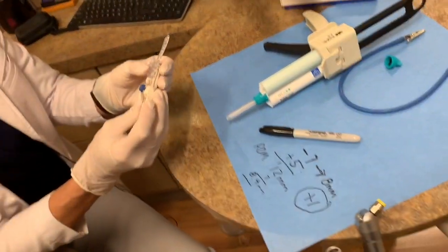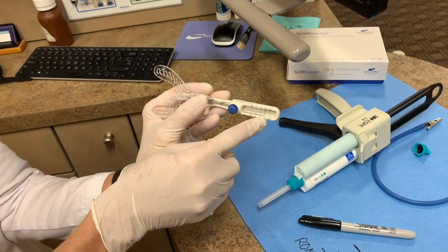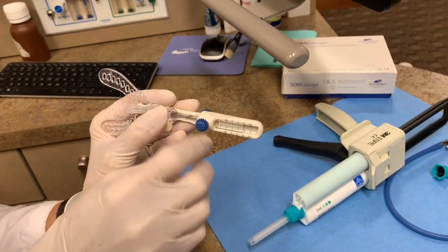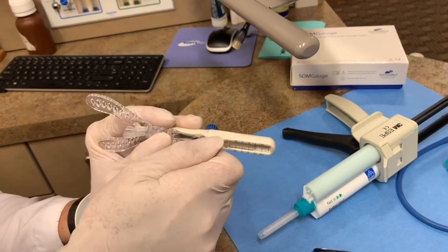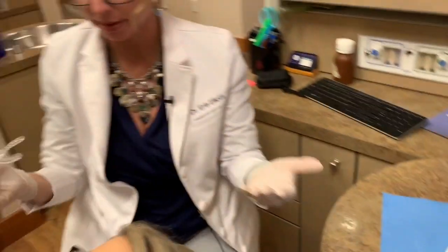So if we go from a negative 7 and move forward 8 millimeters, we're going to set the gauge at a positive 1. We go from negative 7 to positive 1. I put the bite fork at that positive 1, make sure we're in the right positive versus negative, and then tighten the screw so that fork isn't sliding.